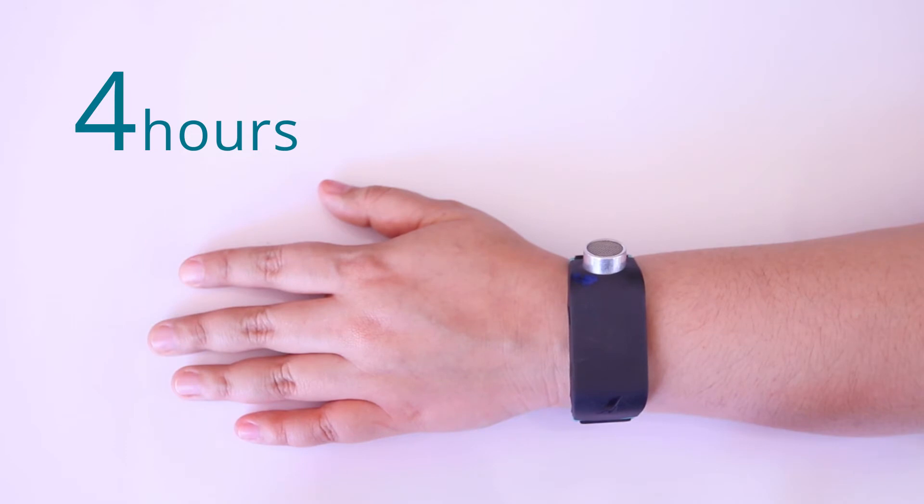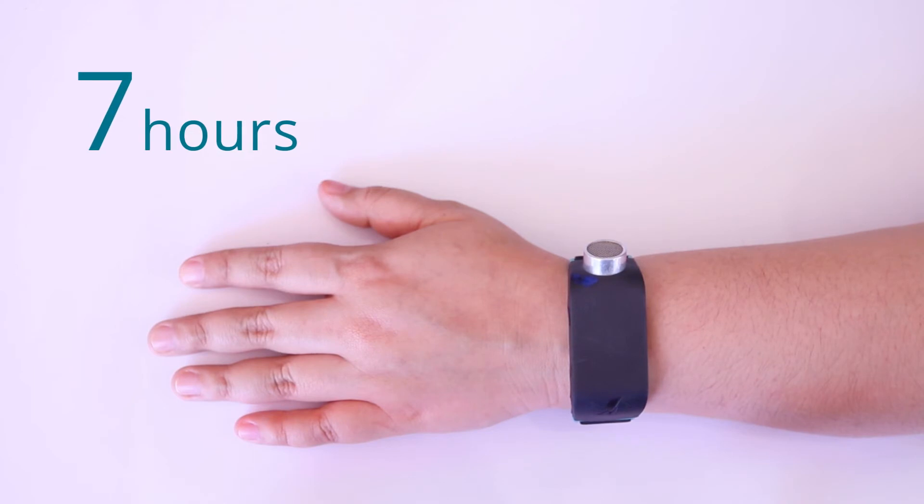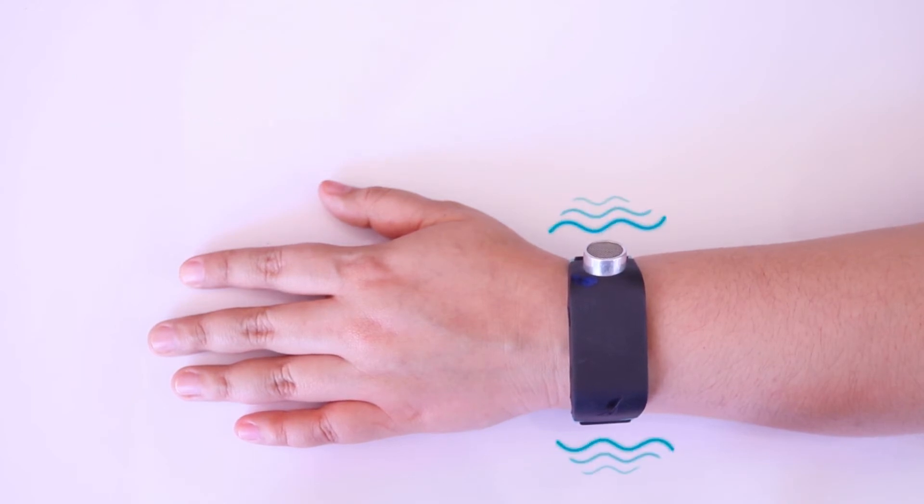Second example: if you swipe in and feel 1 long pulse and 2 short pulses, it's 7. Third example: if you swipe in and feel 2 long pulses followed by 1 short pulse, it's 11.